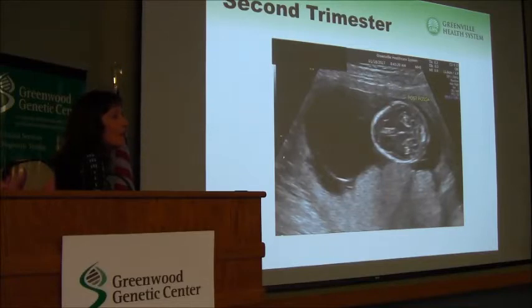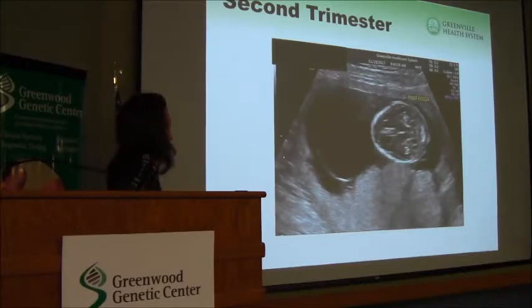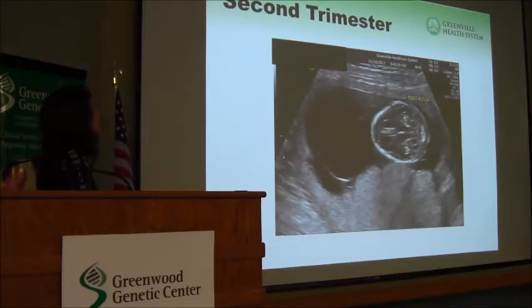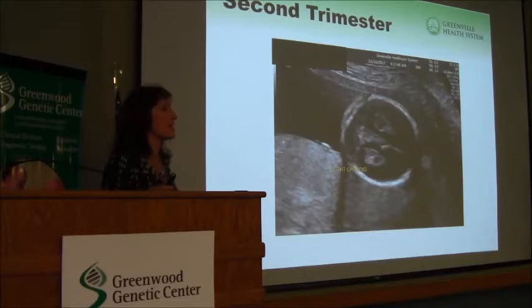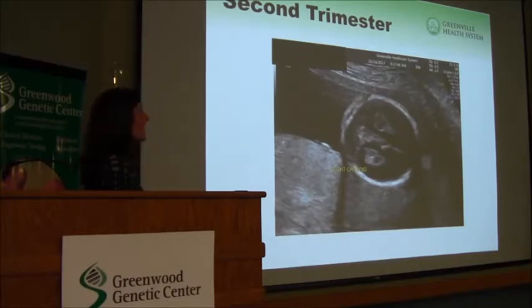That's a neural tube defect. Jennifer? Strawberry shape? Strawberry shape of the head. So trisomy 18. I'm coming to that, Dr. Rogers. It's hard for me to tell a lemon from a strawberry. I know, they're very subtle, lemons and strawberries.